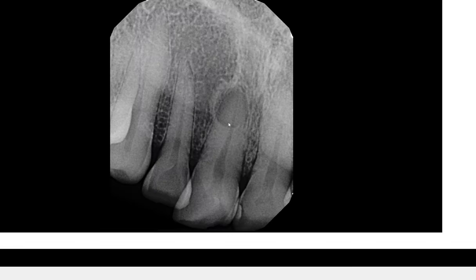Now we're looking at the same area, just from a different angle — a lateral PA projection. This is tooth number eight and nine. And again, we can see that radiolucency. Along its border, it appears to be corticated, at least along its distal border.